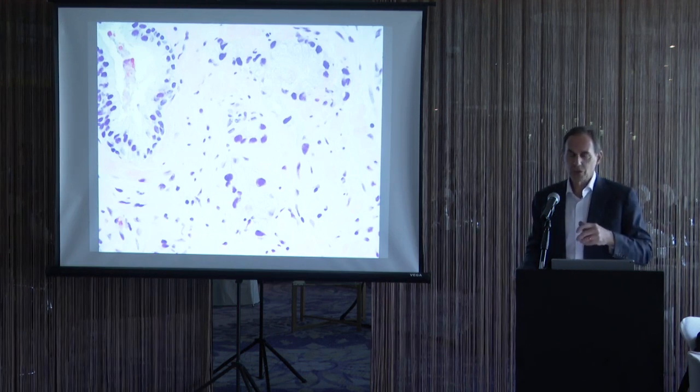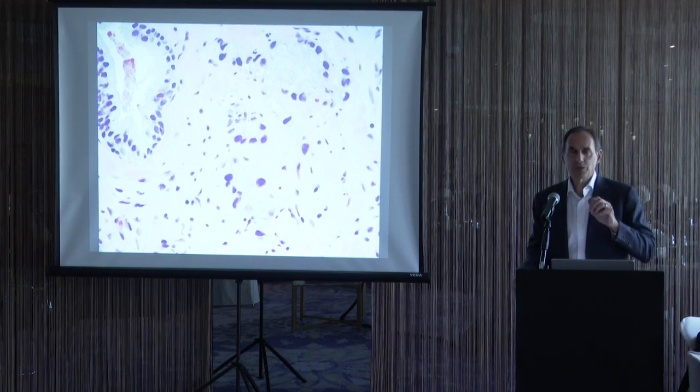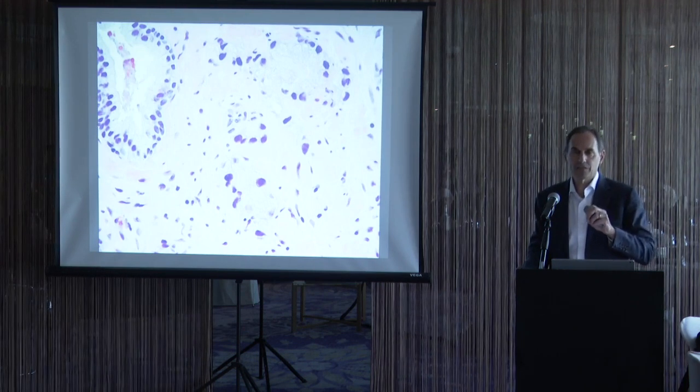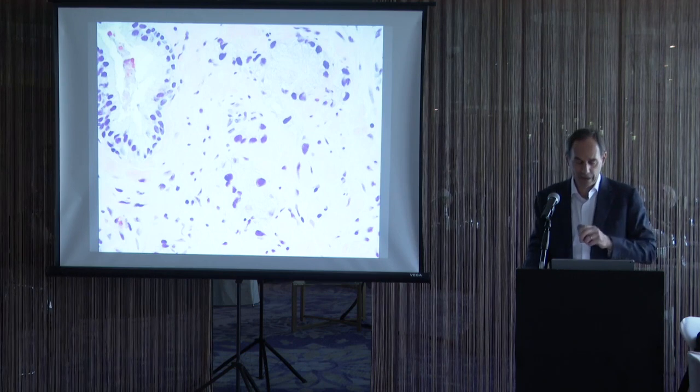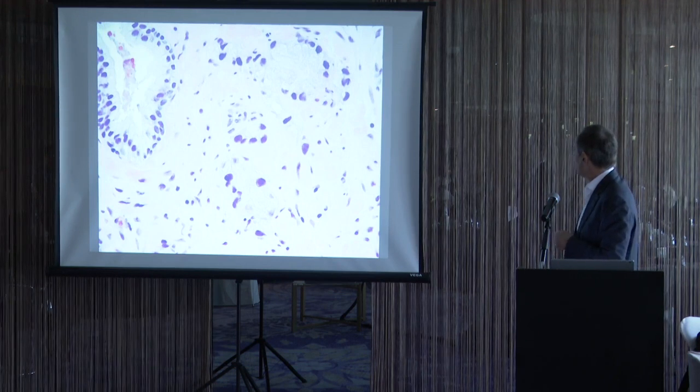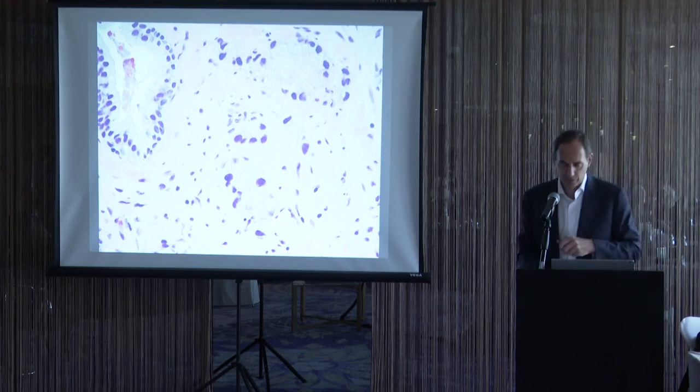Turning our attention to the nuclei, sometimes you don't see prominent nucleoli, but hyperchromatic nuclei relative to the normal is still a feature favoring cancer. So here you can see these enlarged hyperchromatic nuclei relative to the benign glands, which is a good feature for carcinoma.